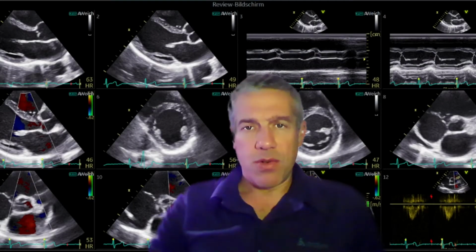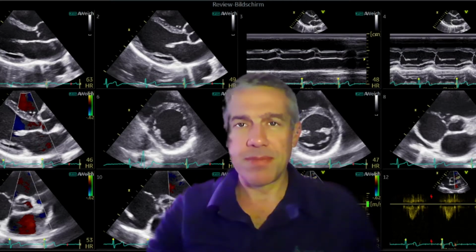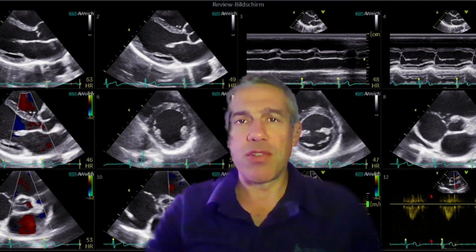In the following video, I will show you the power of 2D strain imaging for dyssynchrony analysis. We will scan a patient with a cardiac resynchronization therapy device with an ICD and two ventricular leads, one in the right ventricle and one on the left ventricular side, implanted epicardially through the coronary sinus.